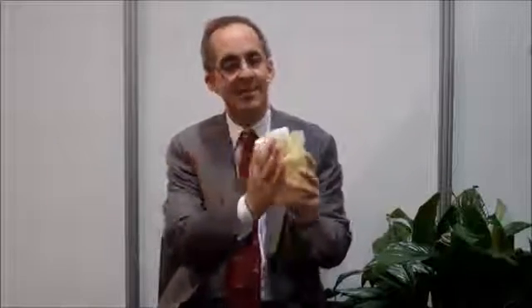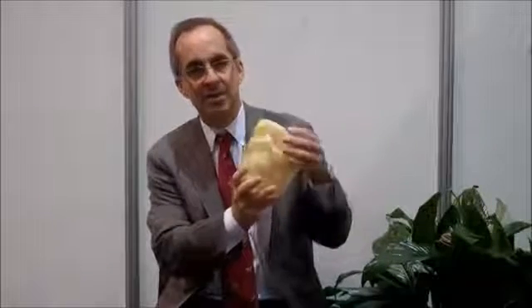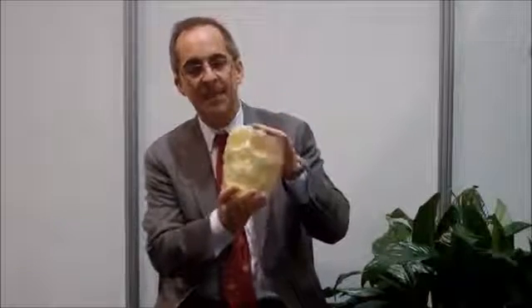One of the things that we found is that these models are highly accurate, and actually printing the 2 models together, we can take Carmen at the time she came to us and take the skull model and actually put it directly into the soft tissue model and have a very accurate representation of what Carmen was in a 3-dimensional printed model at the time before her surgery. So this was the state of her soft tissues and her bone at the time of surgical planning.